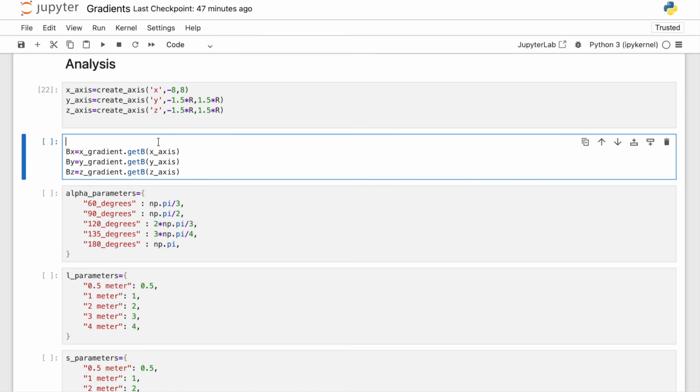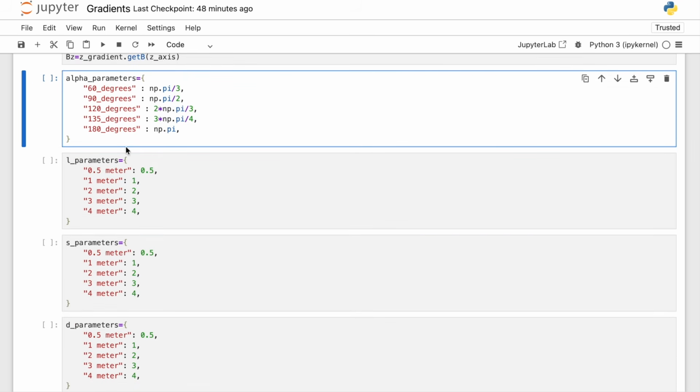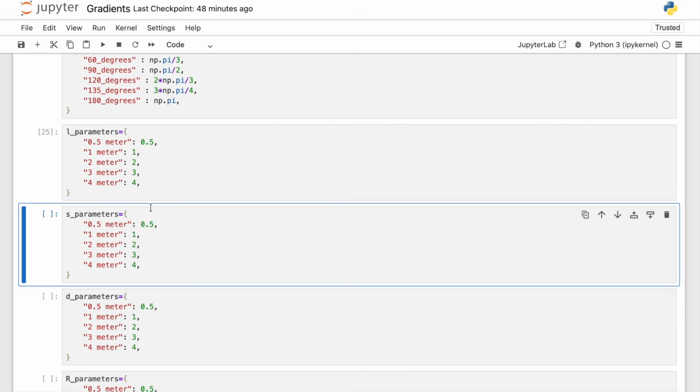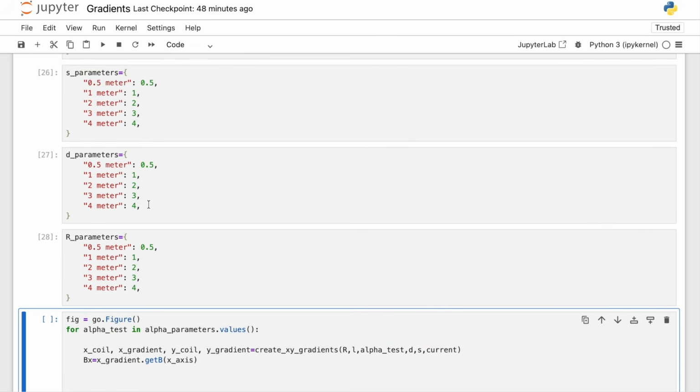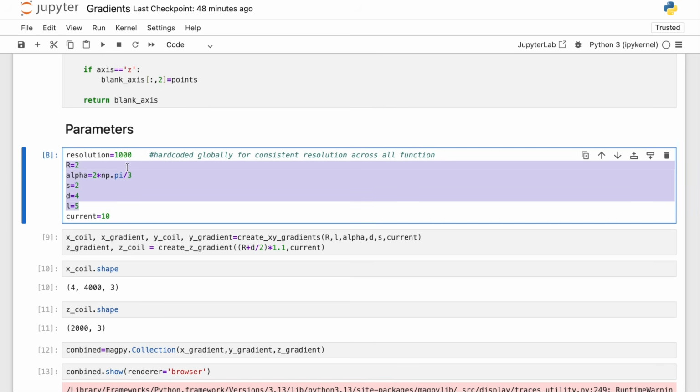So here I will calculate the magnetic fields of x gradient, y gradient, and z gradient by inputting the x-axis, y-axis, and z-axis, which I just defined here. And then here I define the dictionaries for multiple key and value pairs. So I have alpha parameters, which are just different values for alpha. So I have 60 degrees, 90 degrees, 120, 135, and 180, and corresponding radian values. Similarly, I created L parameters for the length, half a meter, 1 meter, 2 meter, 3 and 4, S parameters, D parameters, and R parameters. So basically I have made dictionaries for all of my global parameters here.